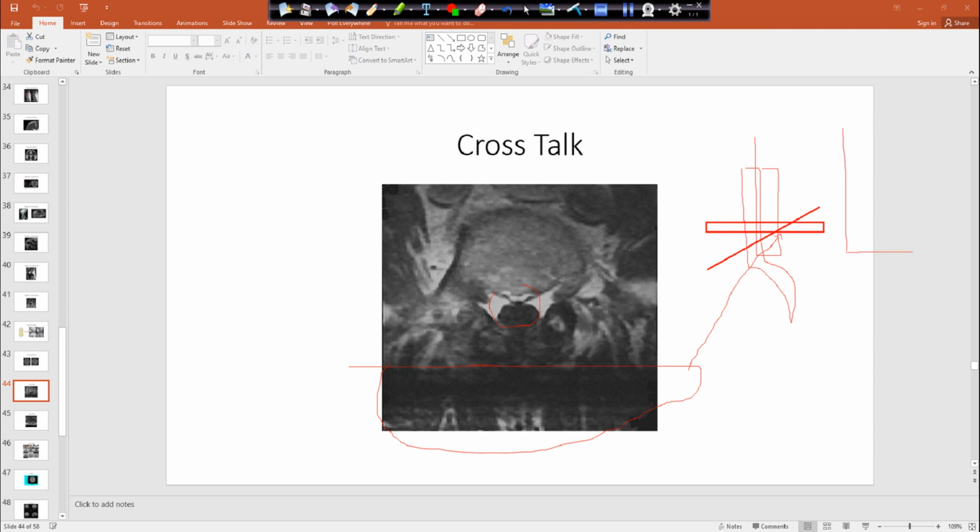So imagine we have our longitudinal axis and our transverse axis. Once we excite one slice here, the hydrogen protons within this area right where they're meeting, we flip it 90, and then there's another slice happening, so it flips another 90, and remember what's happening at 180. It gets completely saturated. So no signal from that area.